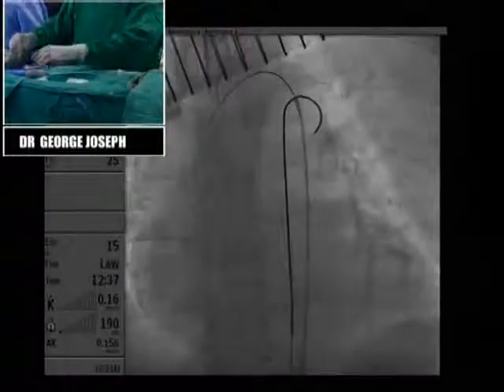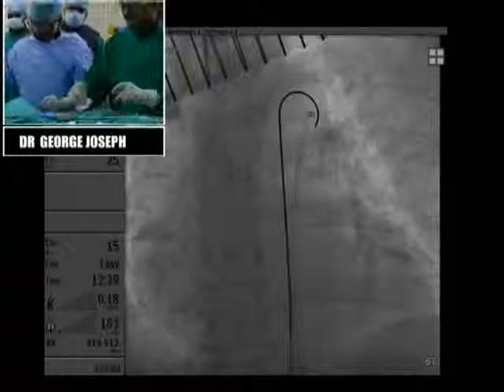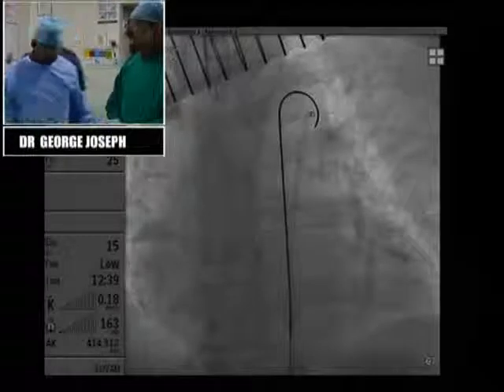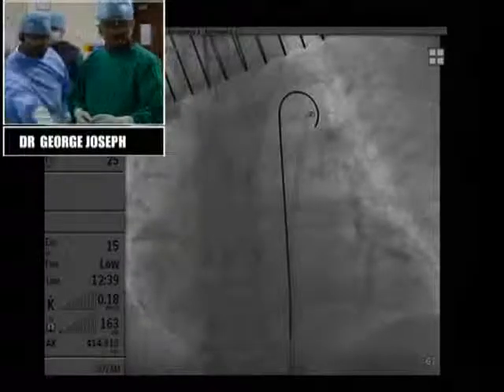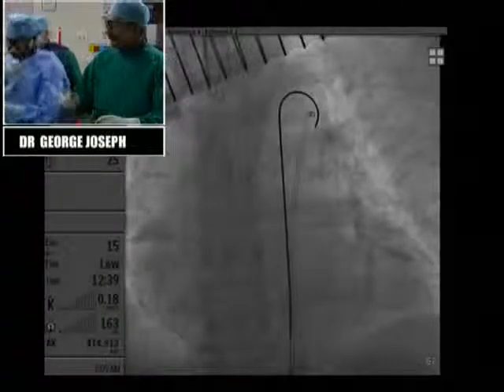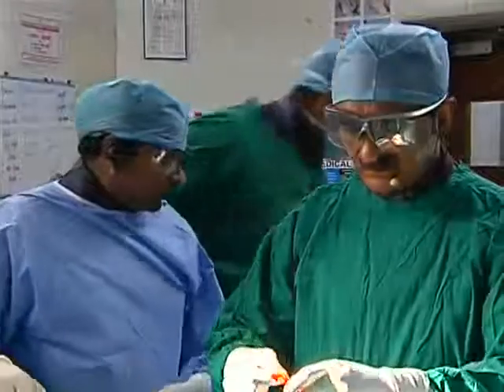This looks perfectly in. Okay, follow it up. Come to AP view. Show up. I found that many times if you're not able to cannulate the contralateral limb, the Amplatz catheter works very well. Then I routinely use Amplatz. With a Wholey wire and a knuckle technique, if you just have a nice U-bend. And obviously if you can't get access, you come from the radial route and snare the wire out from the contralateral limb. Pull the back end out. So we were just discussing some of the methods to cannulate the contralateral limb.